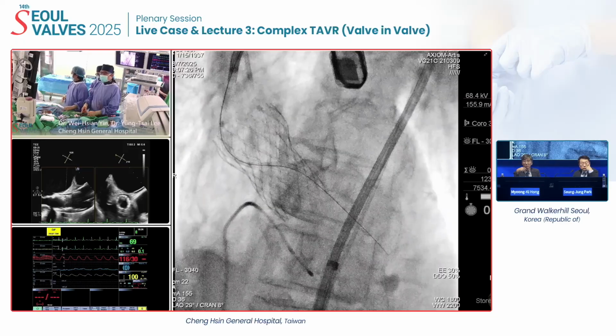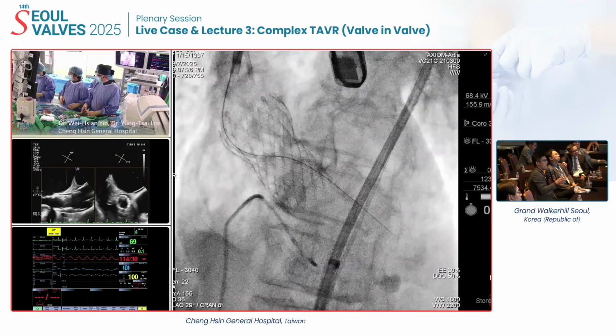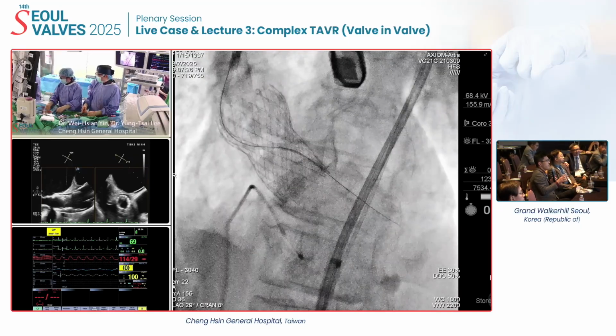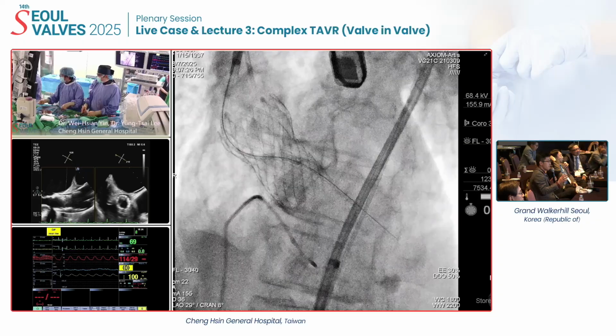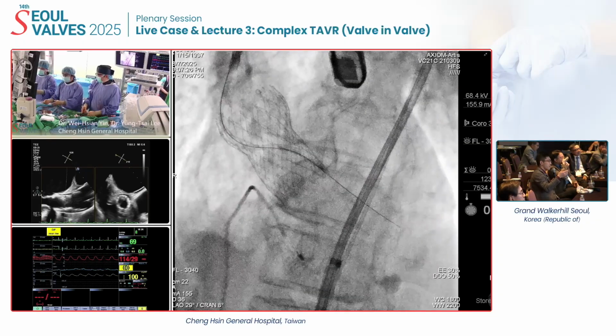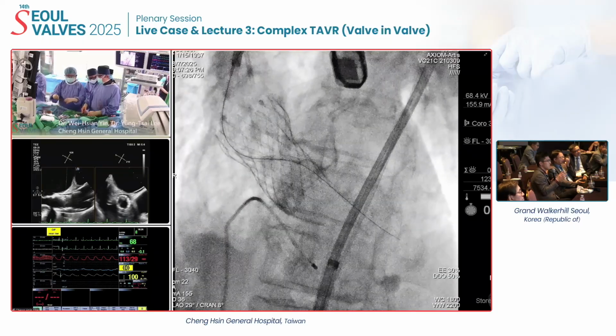I think one of the important parts, just trying to bring up, because everyone is talking about leaflet modification nowadays, we need to know what really leaflet modification is about and the different types of modalities. Basilica here causes a laceration as a tear, and it causes a very clean cut. That's what's really happening. But in unicorn, it's slightly different.